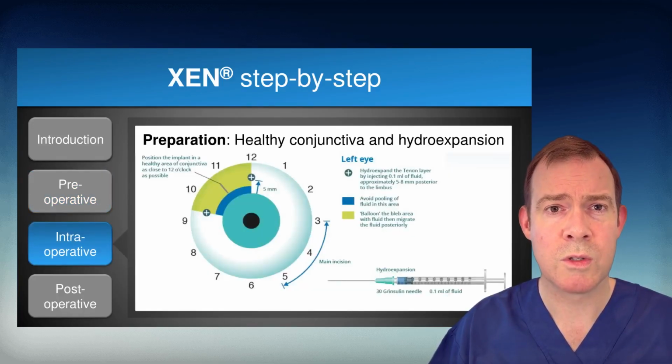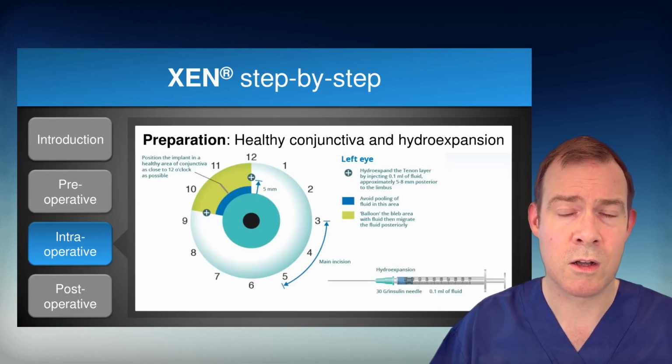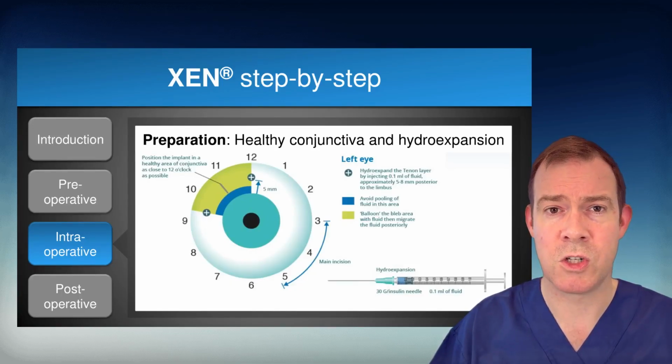This diagram shows the placement of the XEN for a left eye. This mimics what we saw in the video, making the corneal incision between 3 and 5 o'clock. We want to try and inject as close as possible to 12 o'clock. If the incision is at 6 o'clock, it can be difficult to gain access because of the cheek. So 3 to 5 gives the greater access to the space.